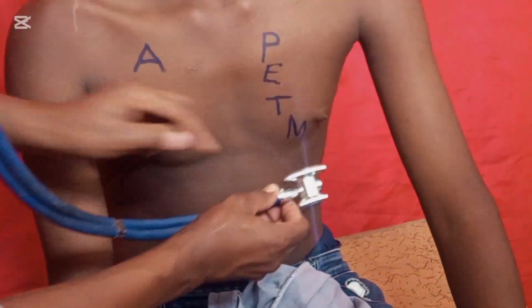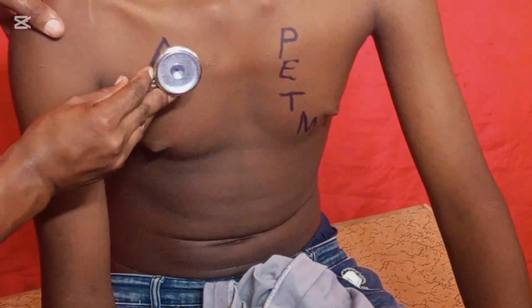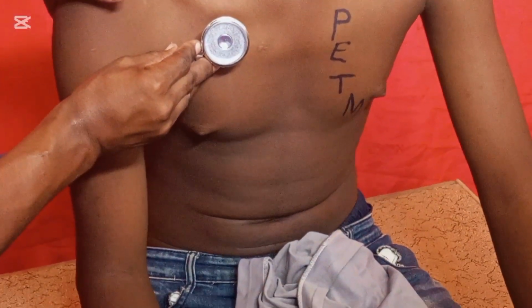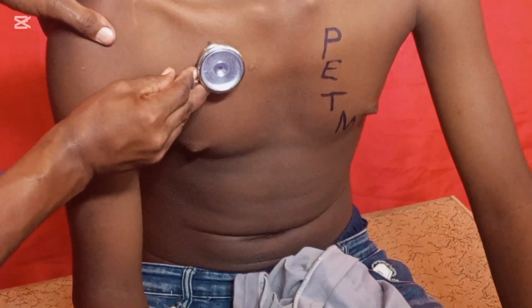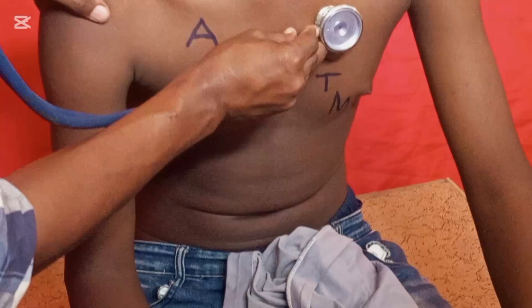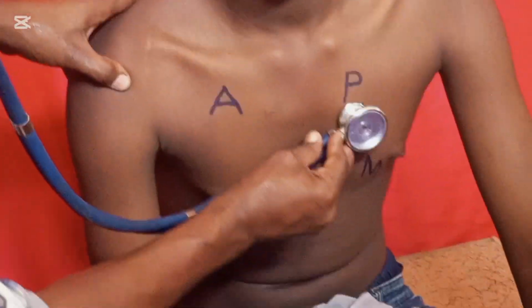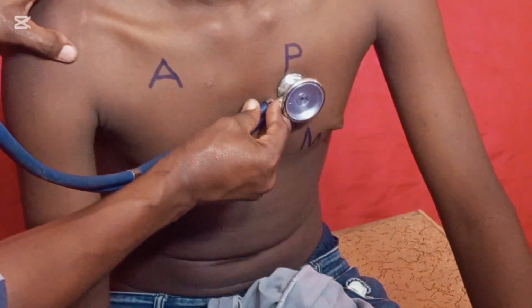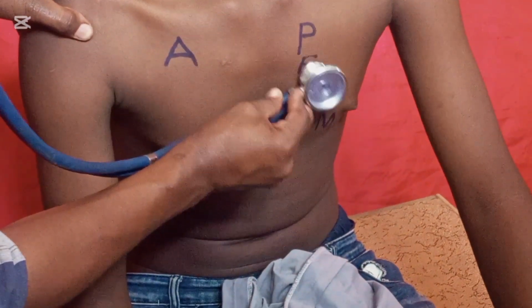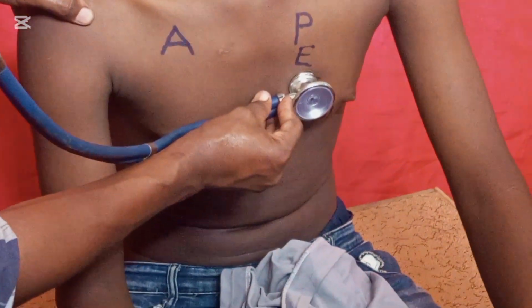Then after listening with the diaphragm, you start listening with the bell. So we start in the second intercostal space on the right side of the sternum. Then we move directly into the second intercostal space on the left side of the sternum. Then we move down into the third intercostal space on the left side of the sternum. Here is the Erb's point.